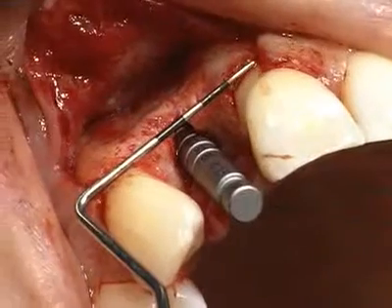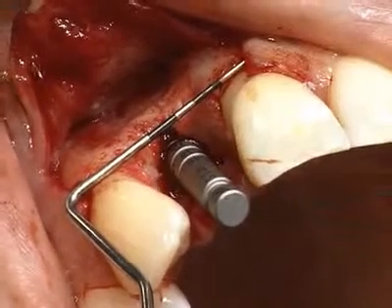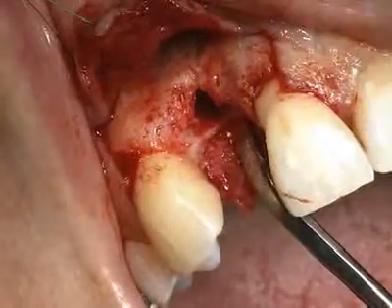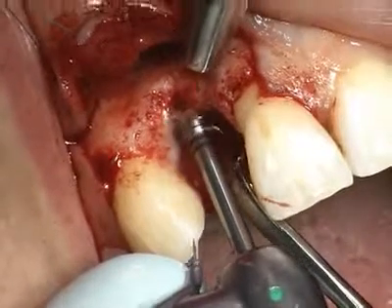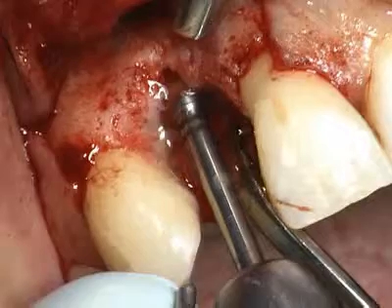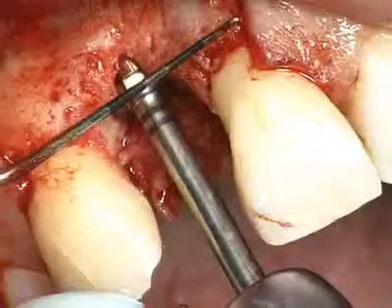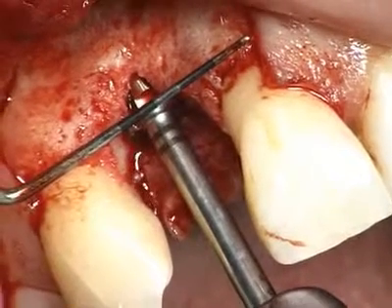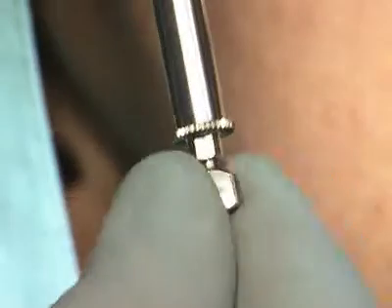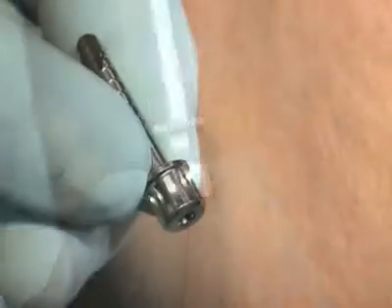The axis and the orofacial alignment permit the correct three-dimensional position of the implant. After the exact depth of drilling has been reached, the flared shape implant neck configuration is transferred to the bone with a 3.5 mm diameter profile drill at 400 RPM. At the same time, the vertical position of the implant is checked. The implant thread pattern is tapped in the bone with the 4.1 mm diameter tap.